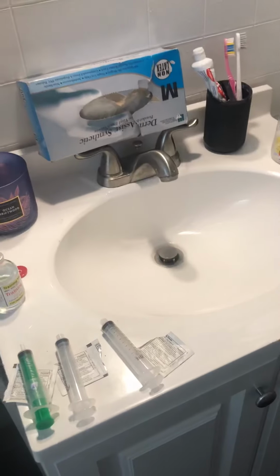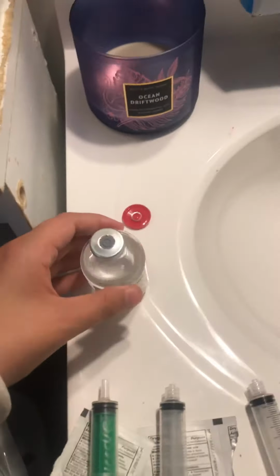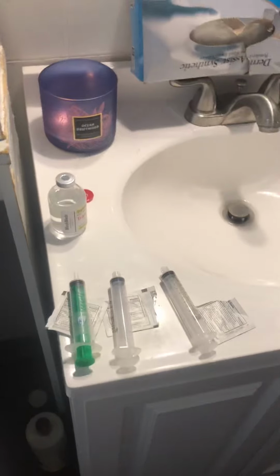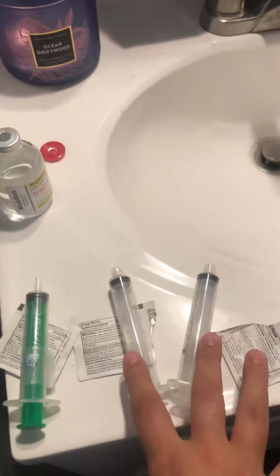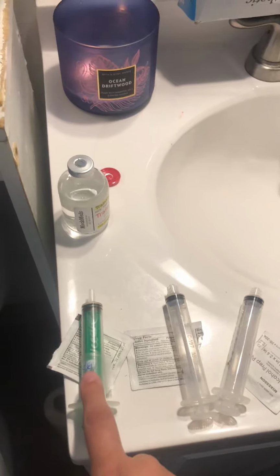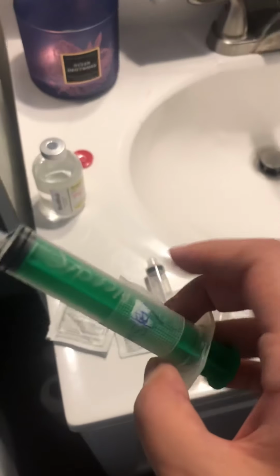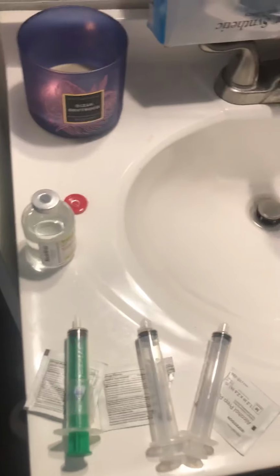So we're going to close the MAR. We're going to close our Pyxis. We have our Lasix, which comes in the vial again. Everything is closed down. We're going to grab our 2 flushes. I have an alcohol prep pad for both. I have their Lasix syringe. It already has a label, so we don't get it confused with a normal saline. So now we are ready to go in our patient's room.